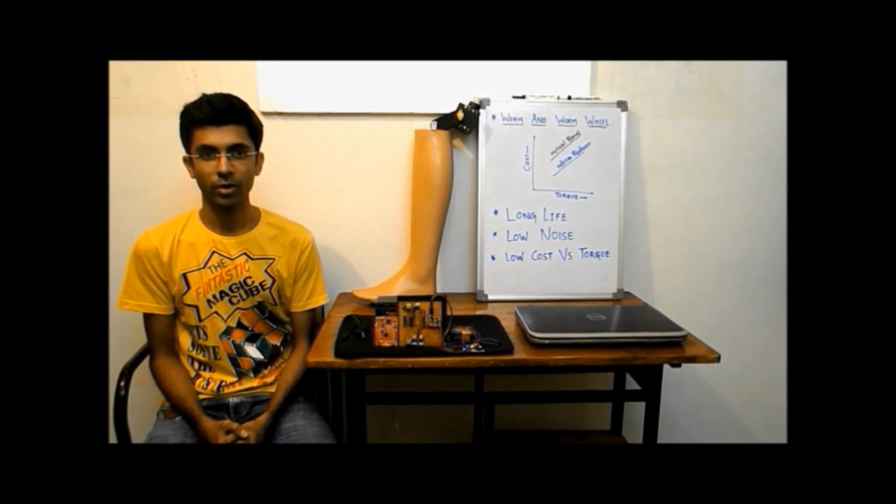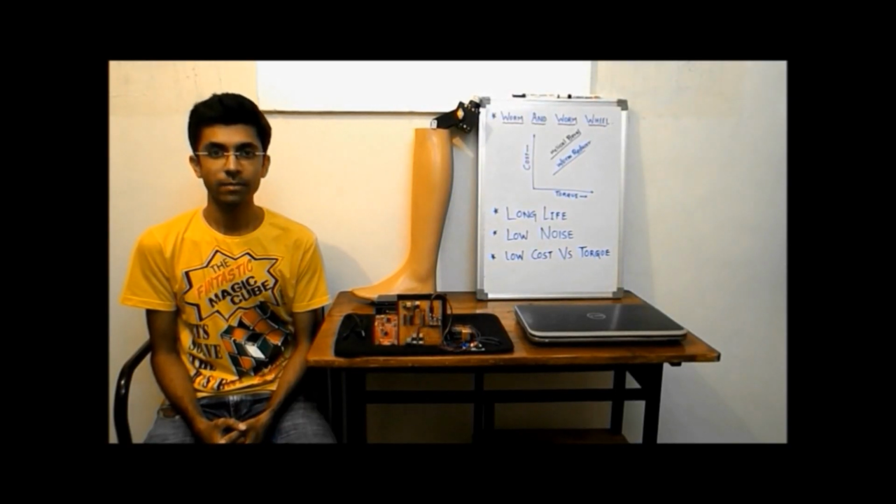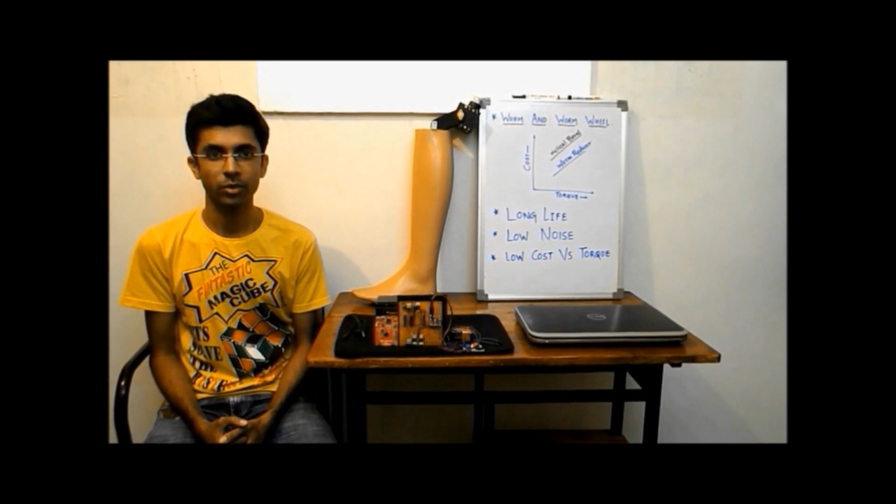Now what is electromyography? Surface electromyography is the technique for measuring levels of muscle activity. When a muscle contracts, electrical activity generated as action potentials propagates along the muscle fibers. We attached electrodes to the skin of the healthy leg, measured the muscle activity and graphed it as the person moves through various ranges of motion.